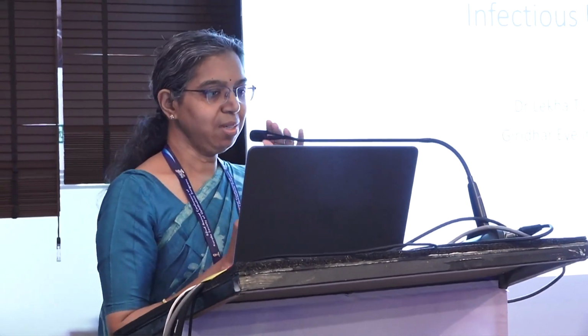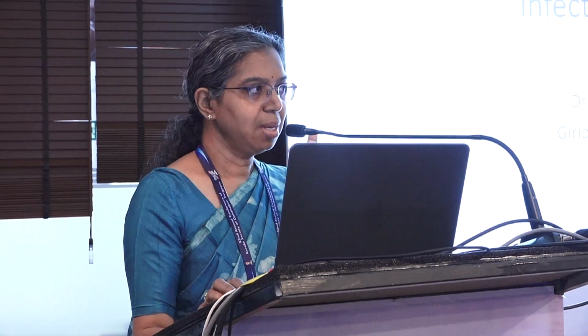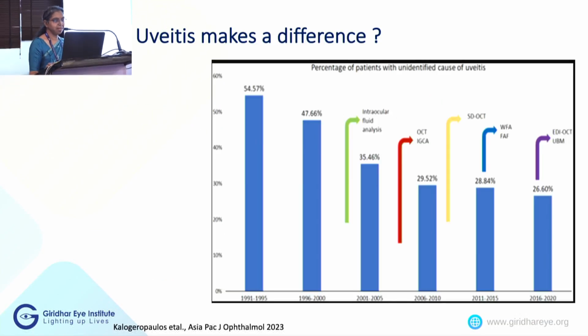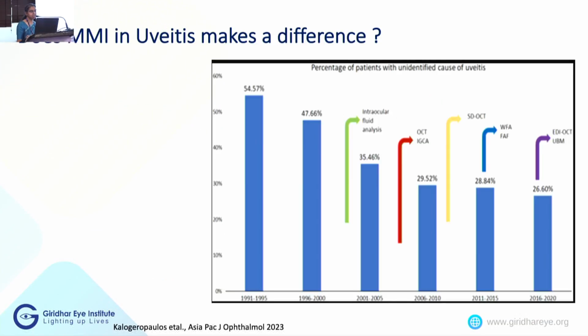Good morning, everyone. I'll be talking on multimodal imaging in uveitis, and there might be little repetition or overlap with some of the cases which have already been discussed previously. So does MMI actually make a difference in uveitis? Yes, we have the evidence here.